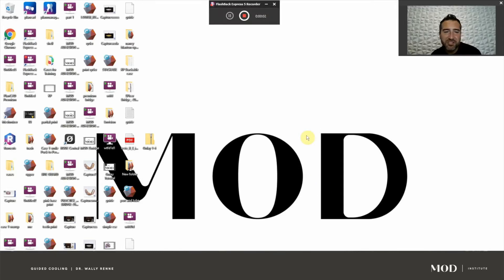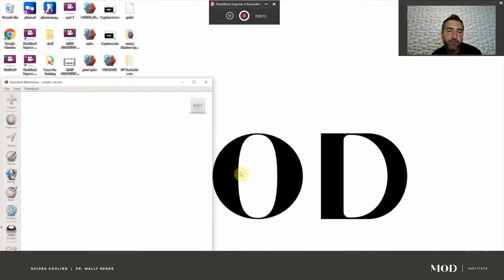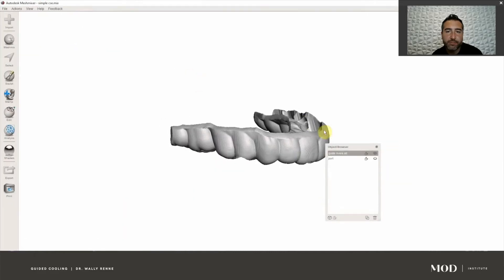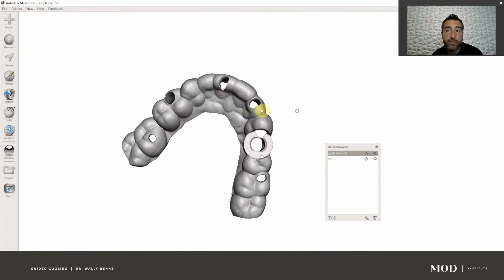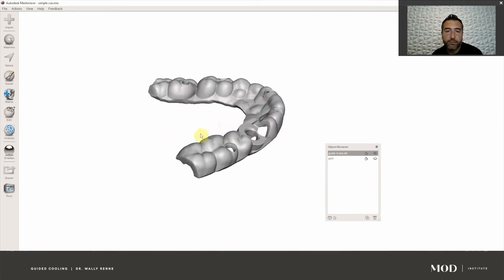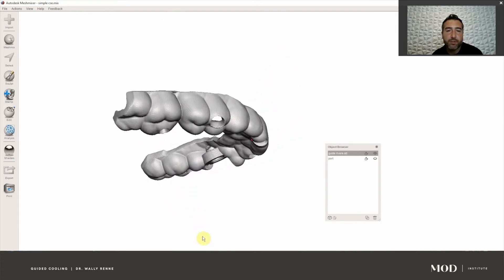Hey everybody, Wally Rene here from the Mod Institute. We're going to go over this quick guide on how to add a single irrigation tube to a simple surgical guide. Download the case from themodinstitute.com — this is the simple case, follow along with me. I'm going to try to go extremely slow. Pause the video and rewind if you need to. I'm going to add some callouts to this video to help slow it down as well.